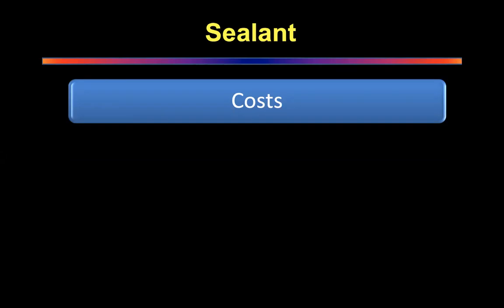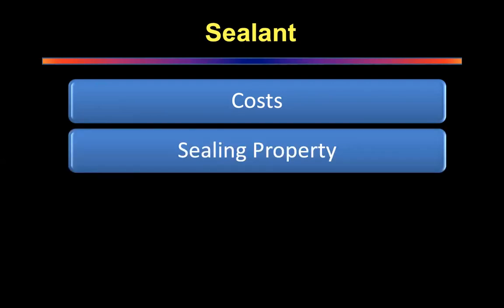Always make sure you're not being penny wise and pound foolish. Very often I've seen surgeons not open the correct device on the table and then have problems afterwards and end up spending 3 times more in the post-operative period. So cost is always a relative topic. You must balance things out before you decide to use or not use a product on cost alone.